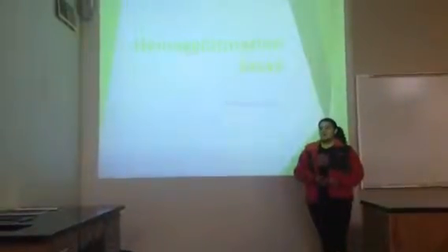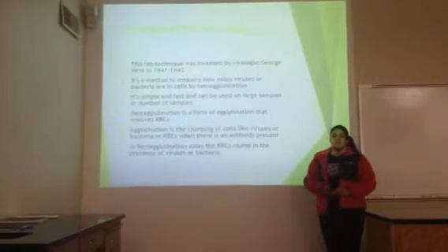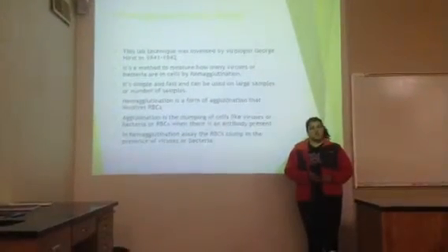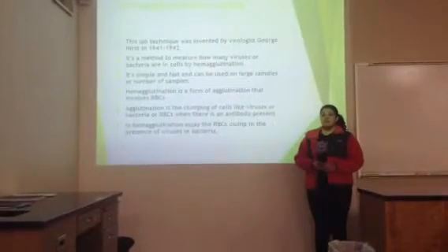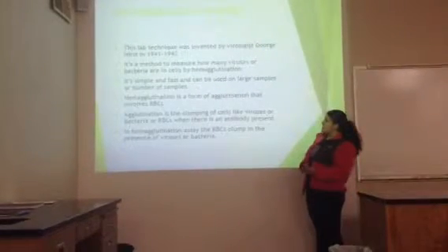So the lab technique I chose to do is hemagglutination assay. This is a technique invented by George Hirst in 1941-1942. He was an American virologist. It's a method to detect viruses or bacteria using red blood cells.